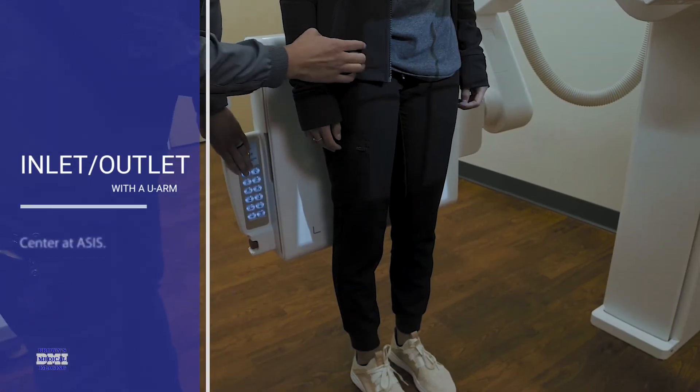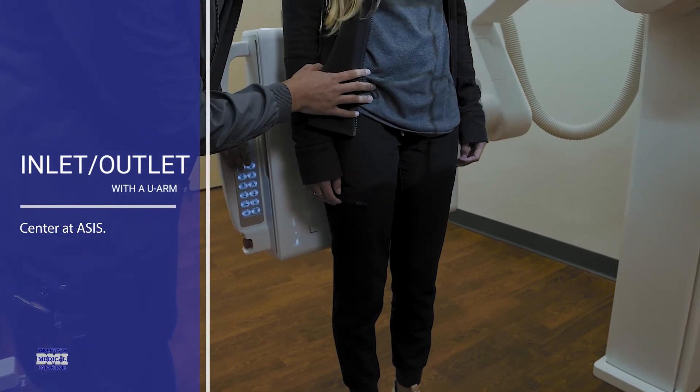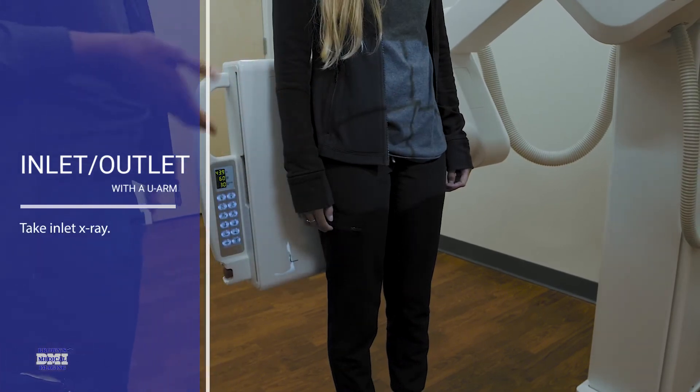We're going to center at about the ASIS, line her up midline, and then you would take your inlet photo.